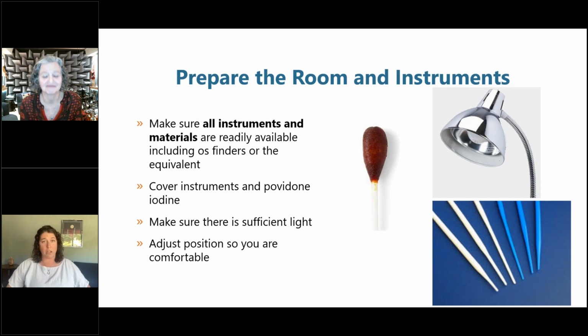Yes, just putting it on the low belly can help with the cramping, and it's also another way to shift the sensation, so the client can focus on the warmth on their low belly as an alternative place to be feeling sensation in their body. And this one seems really obvious, which is to prepare the room, but we've been around a while, Julie. I've been to a lot of sites.